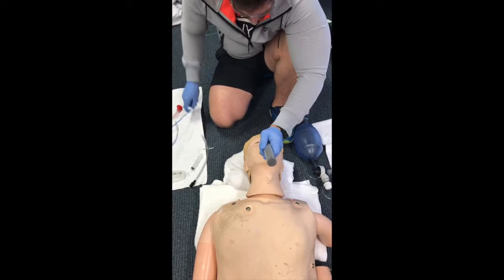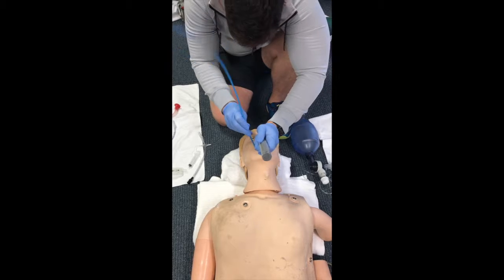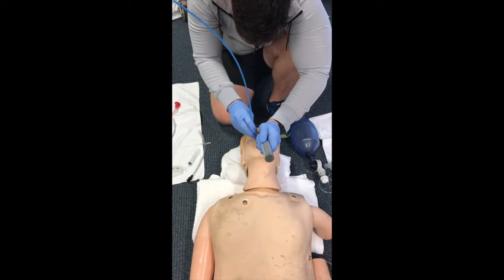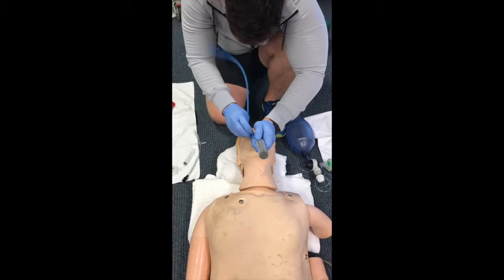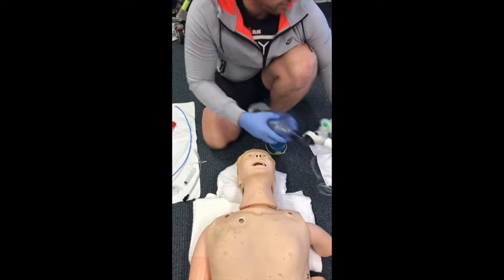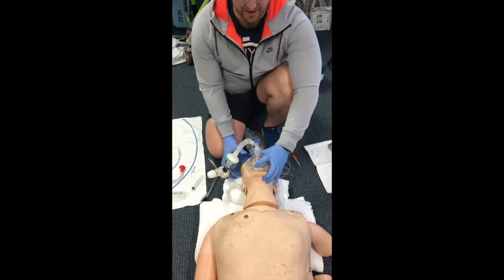For my second attempt at intubation, I utilise the bougie. I can place the bougie, and if I can place the bougie through the cords, I can blind place the ET tube over the top and check for objective measures such as end tidal waveform. Or if I'm unable to pass the bougie at all, I resort back to BVM ventilation. Okay, so I was unable to intubate my patient on my second attempt.